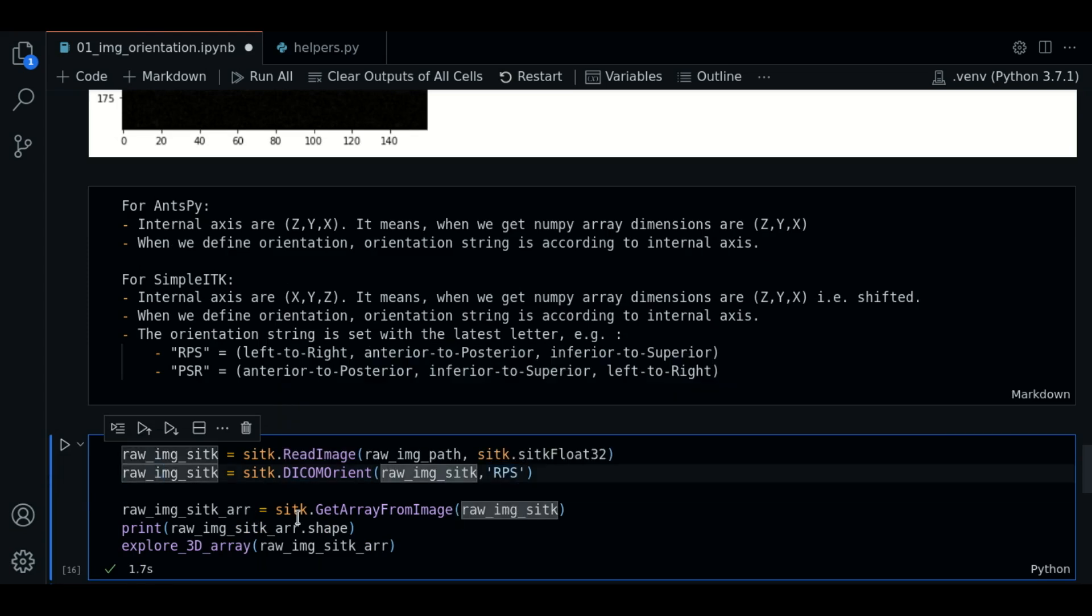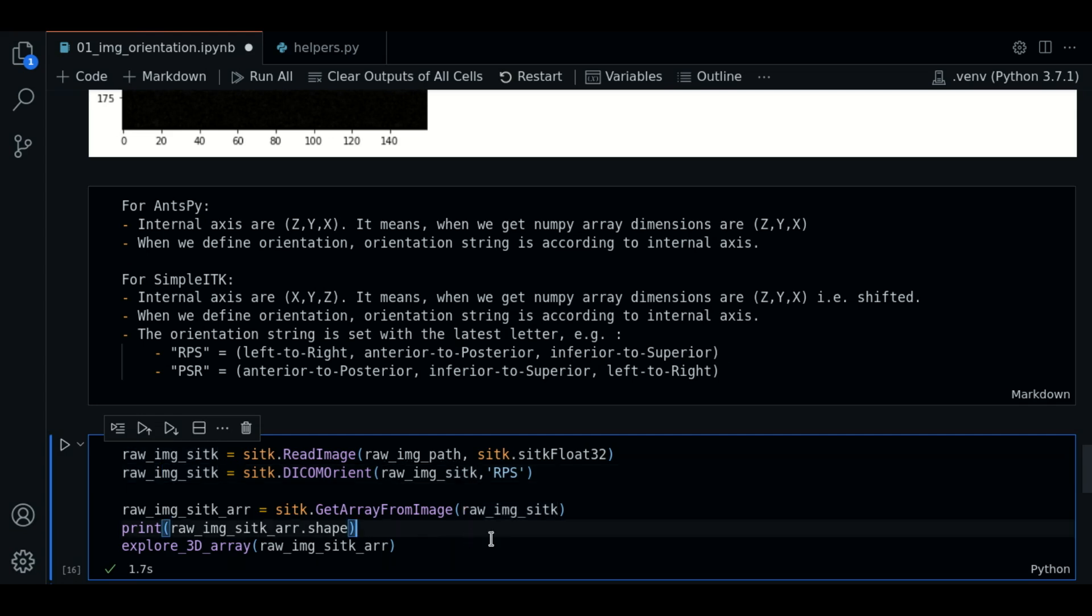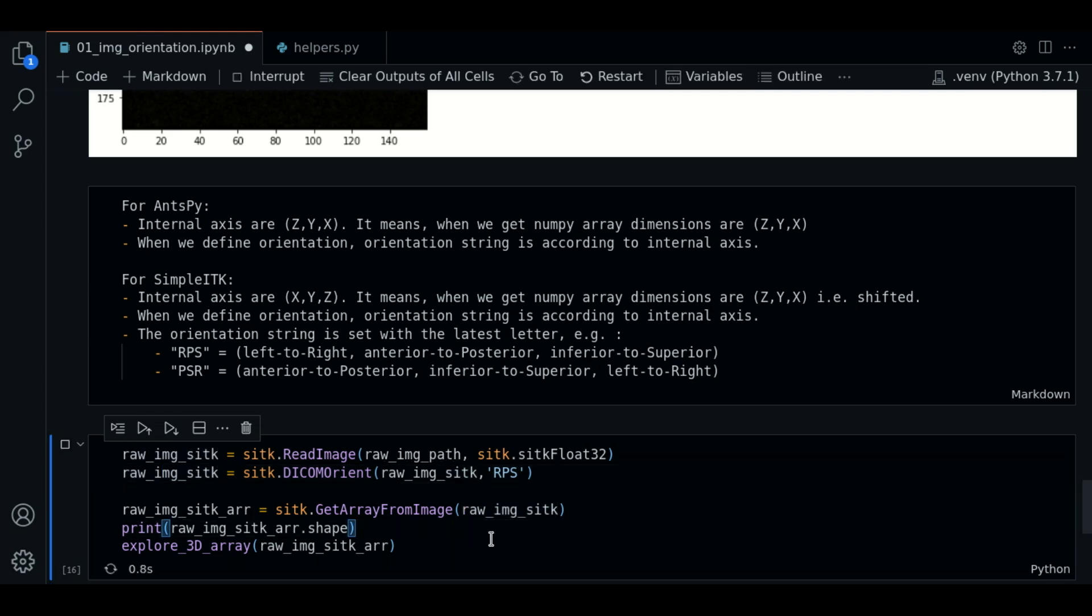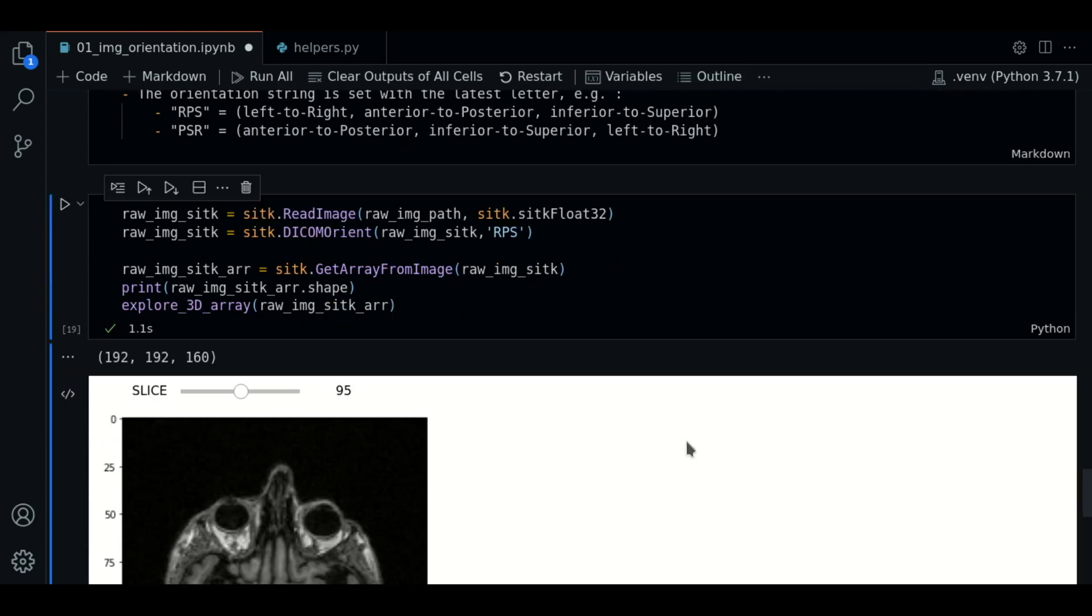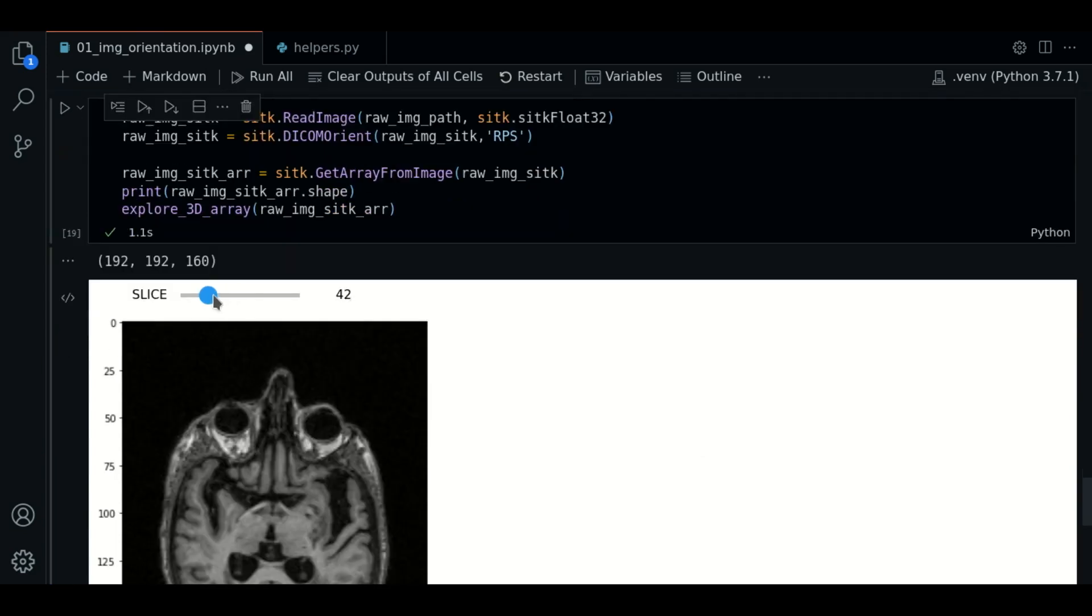This will be all to reorient the image. We get the array and we plot the image. So, we press enter and there we go.